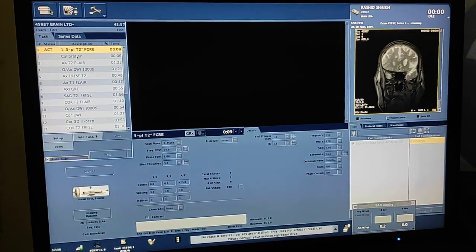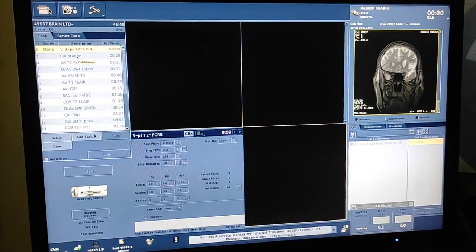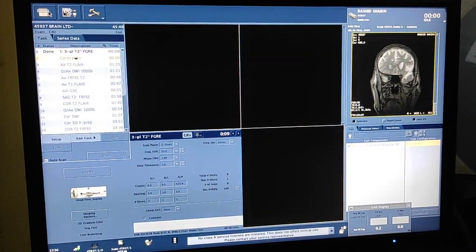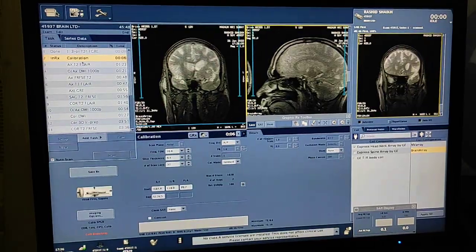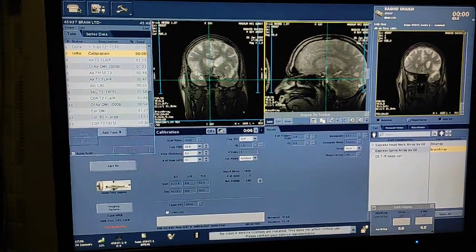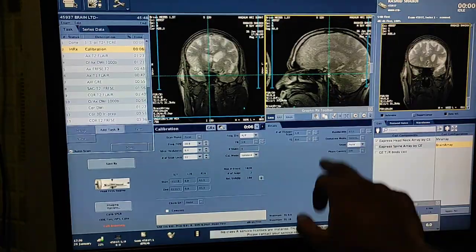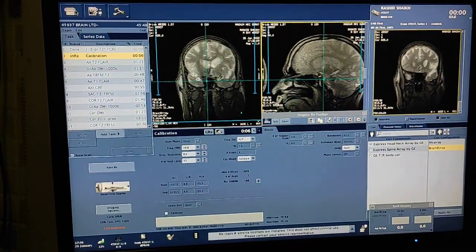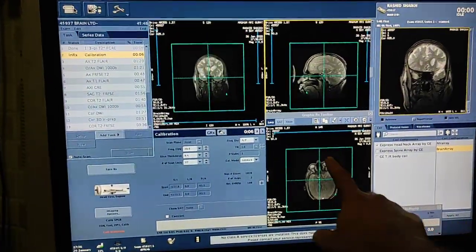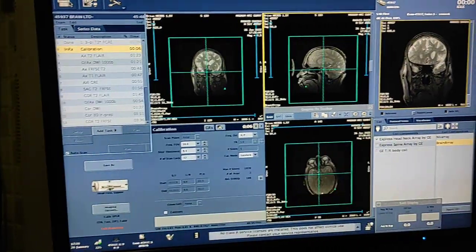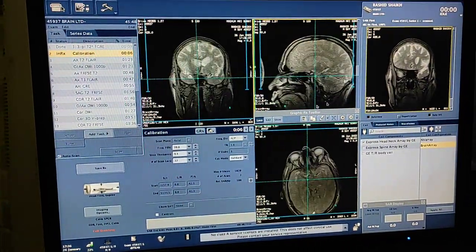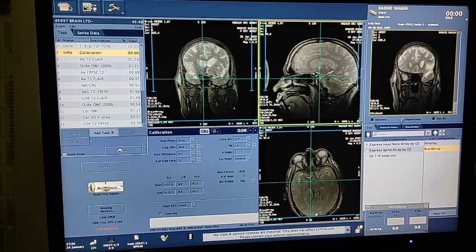Then we have to run calibration. Double click on calibration, then click on any of the boxes — coronal, sag, or axial. You have to just calibrate this triplane localizer. Save RX and scan.